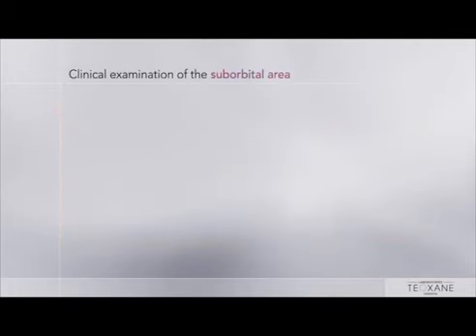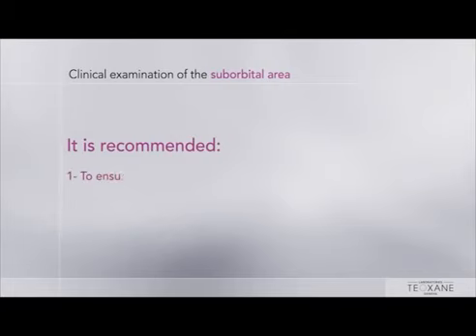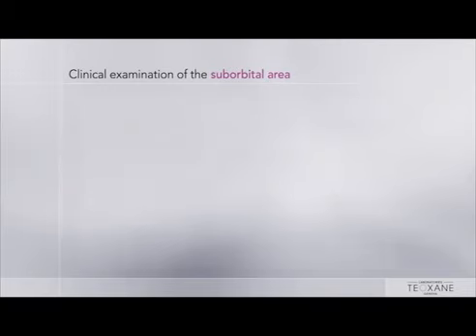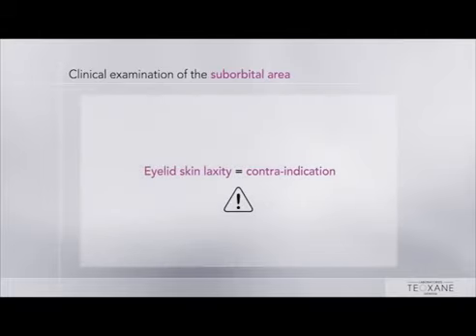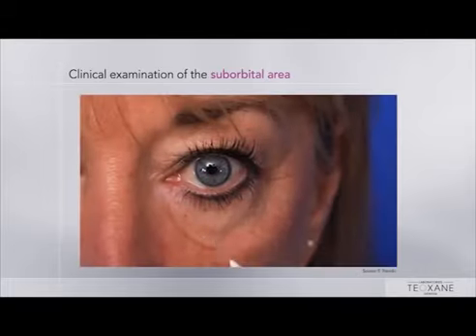Before all injection, diagnosis and assessment of the patient's dark circle, tear trough, and palpebromalar groove must be done in a semi-sitting position. It is recommended to ensure the absence of malar bags and to perform a snap test to ensure the absence of eyelid hyperlaxity. Eyelid skin laxity is a contraindication to the injection of the dark circle. The malar pocket is one of the signs.